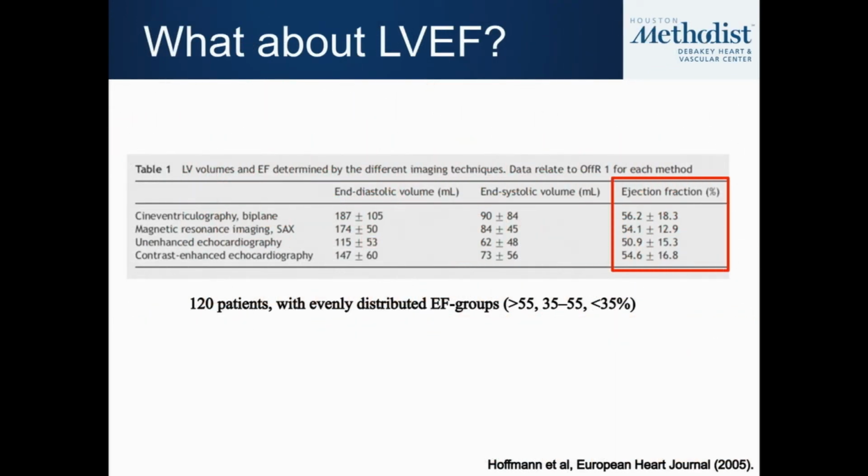What about ejection fraction? So in this particular study from 2005, if you compare contrast versus non-contrast echocardiography, ejection fraction, I think it's a reasonable conclusion to say that whether it's visual assessment or contrast or non-contrast, and like Dr. Chang was saying, in an expert hand, it's probably reasonable to use any of the above because the prognosis may not necessarily be different between someone who has an ejection fraction of 43% versus 46%.